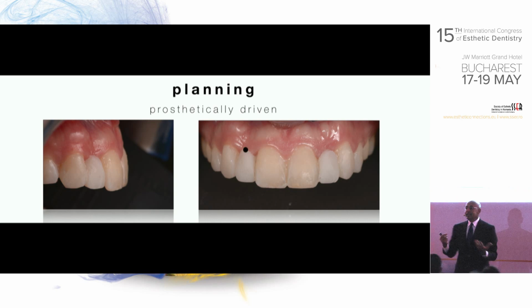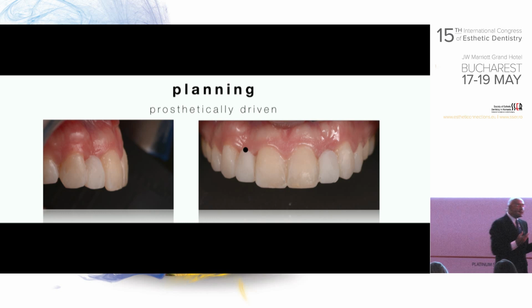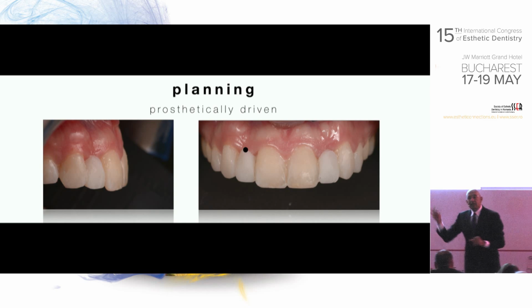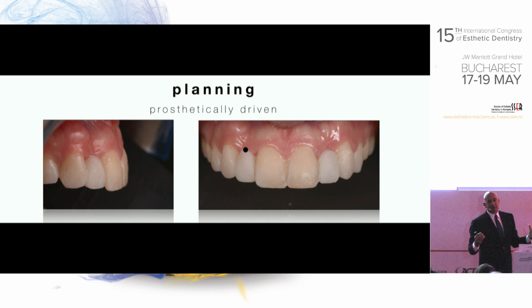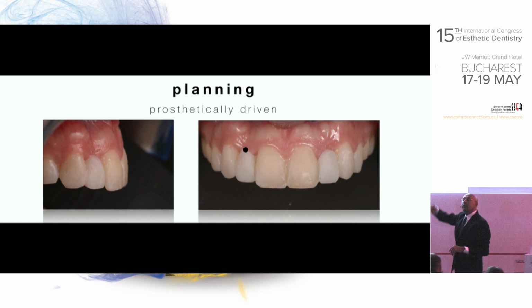And having said that, why is this so important? These are very small details, but this is what makes you look better than the other colleagues. So let's say, in this case, we decided to have more of a squarish to rounded teeth. And the zenith point will be different if it were triangular teeth. So this zenith point, as you see here, is not only vertical.